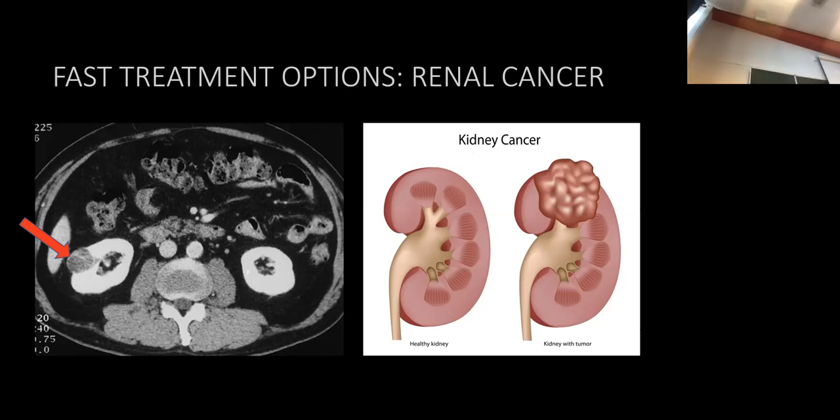So what happens basically is that the urologist, that's the specialist here that treats those kind of issues, said, okay, let's do an MRI or a CT scan with some contrast. And then you get a cross-sectional image of the abdomen at this location, the belly. What you see here is a lot, but you see two kidneys. That's good, you have two, that's a nice thing.